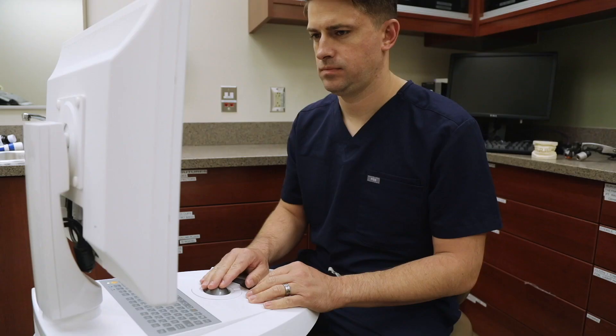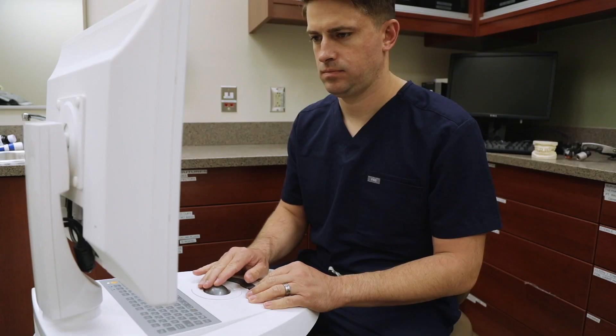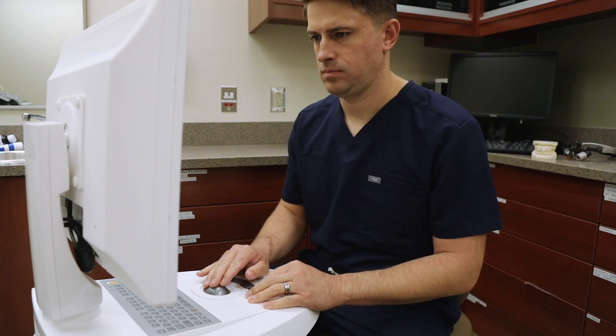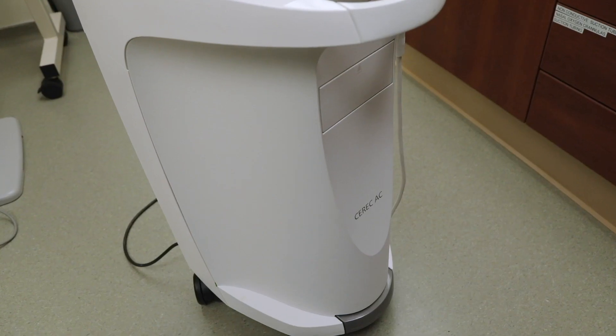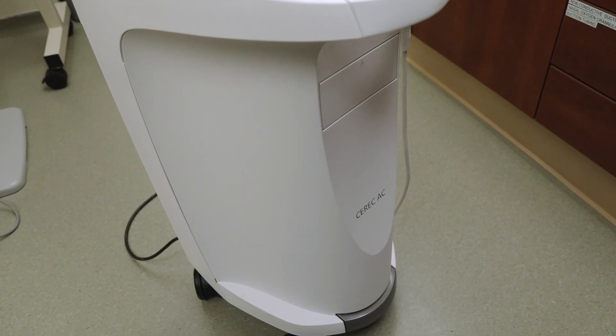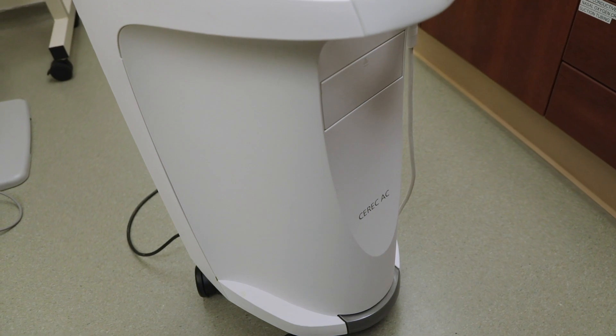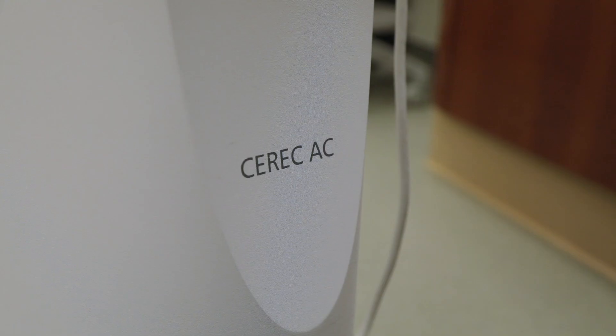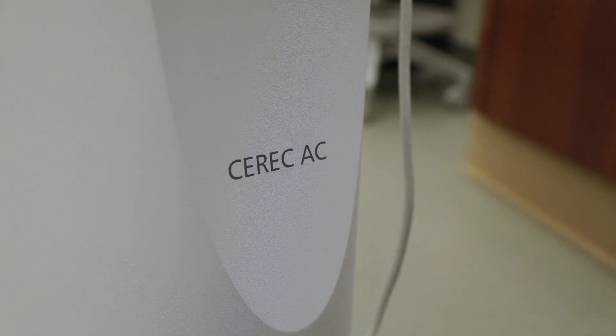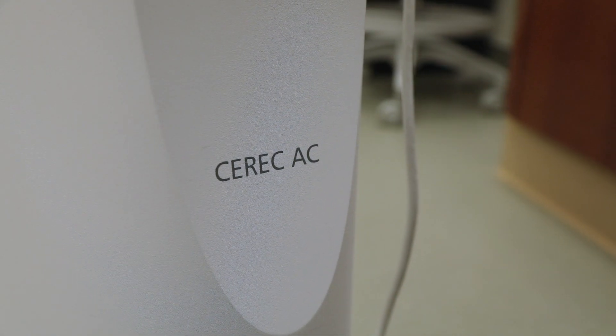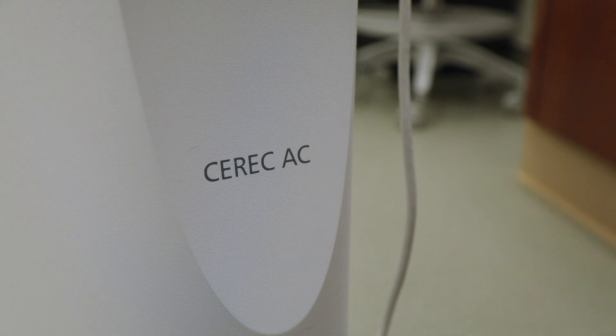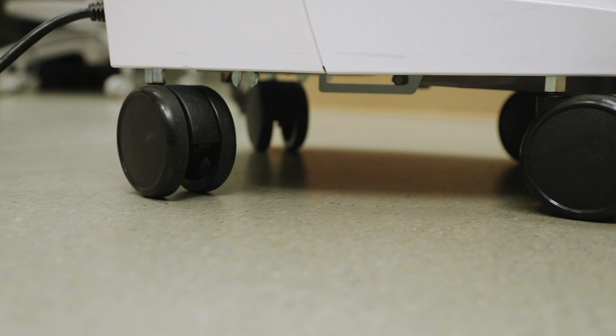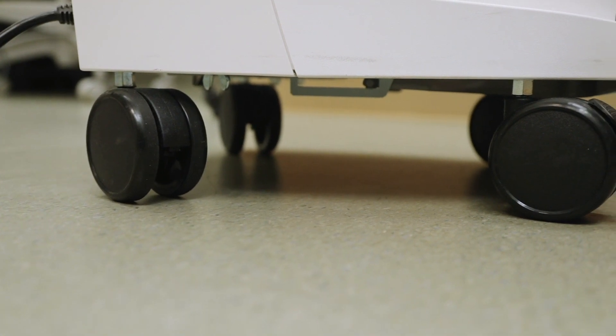Before we jump into the software, let's take a look at the machine. The base of this machine is where all the major computer parts are located. This is a wheeled device and can be transported from room to room.